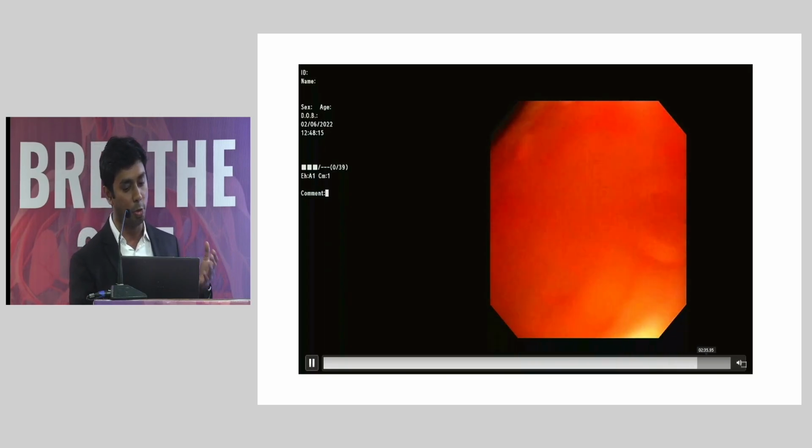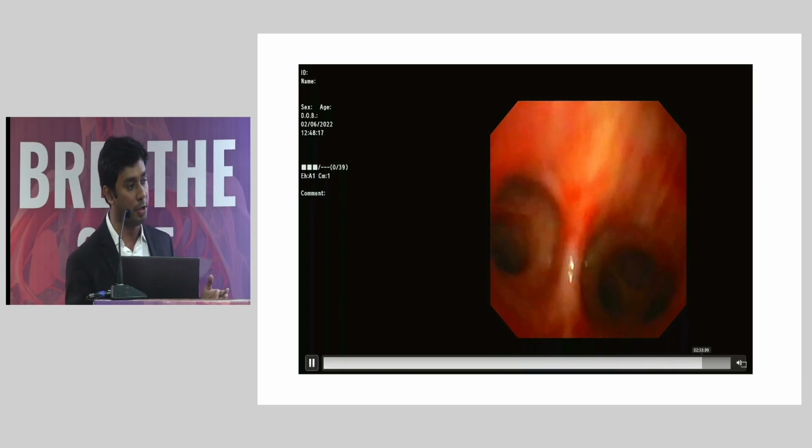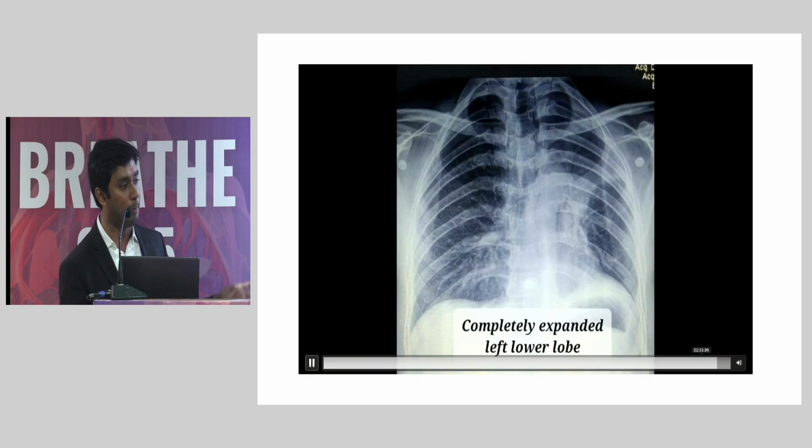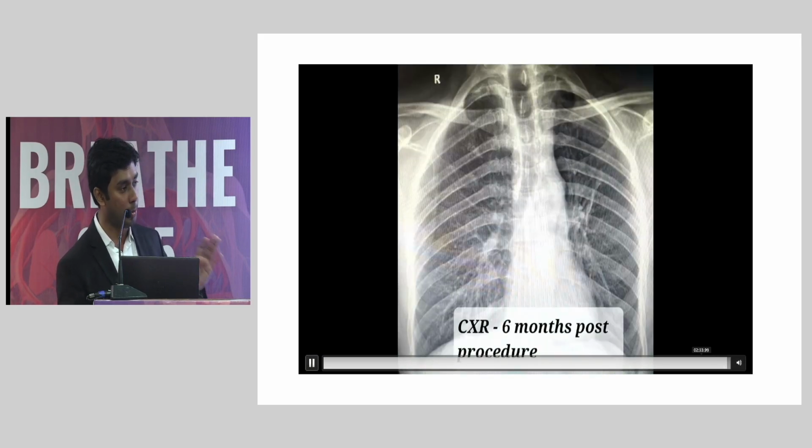But you will be seeing, to our surprise, this patient was extubated on table and his saturation was 94, with an X-ray looking like this. Immediately post procedure, there was a complete expansion of the left lung, and this patient is almost 2 years into follow-up. Now the patient has a complete expansion, and a patient who was considered to be oxygen dependent is now moving and doing all his activities by himself.